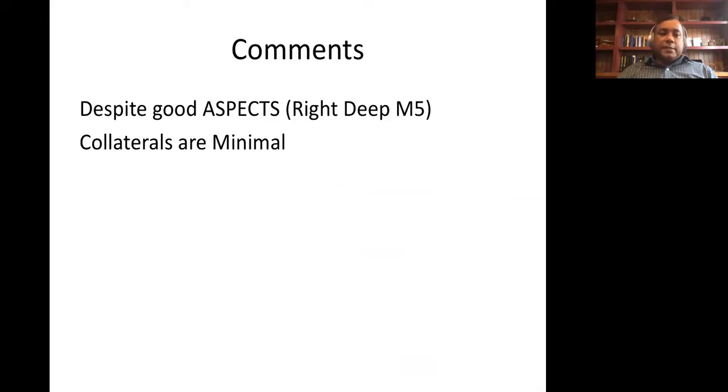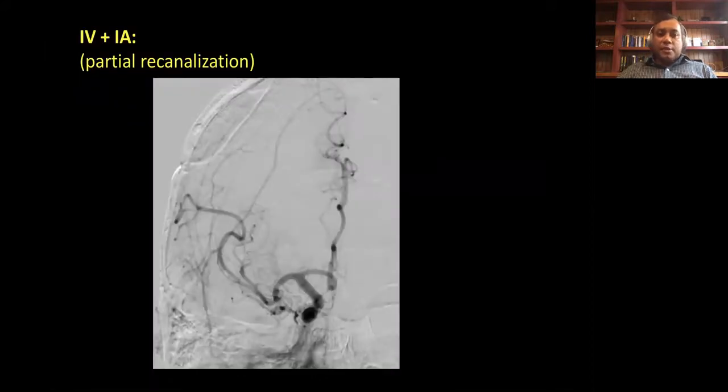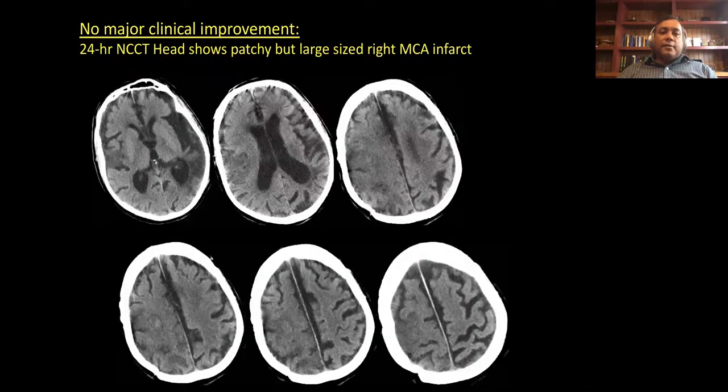So collaterals are minimal. The patient did get IV, and went endovascular. This was some years ago. But we didn't find any major clinical improvement. And as you see with these scans, the patient had lots of patchy infarction and didn't do as well.